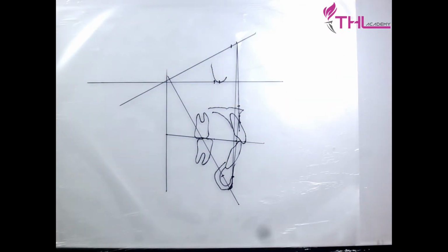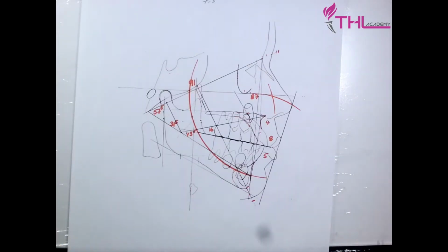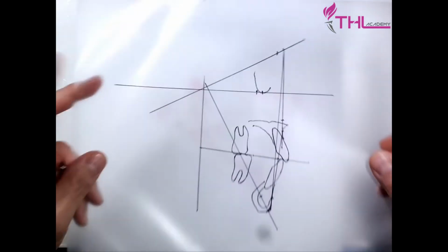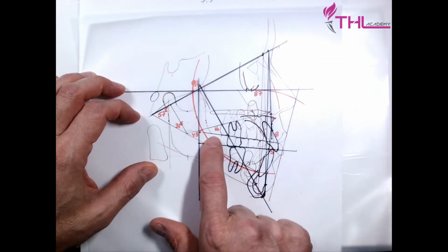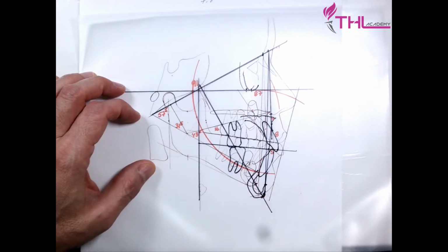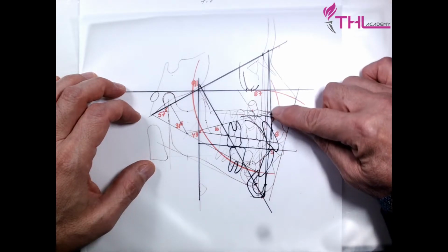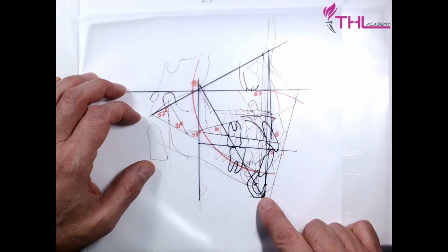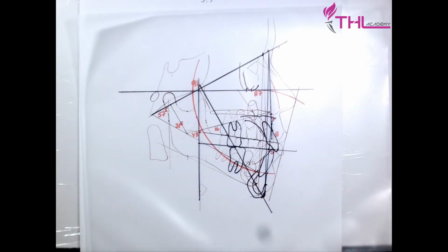This is a simplified VTO. What is the use of this? If I see this is the original patient, quickly I can put this in place and I can see the occlusal plane going down. Oh, I like that. I can see the parallel drop of the palate. I can see how much the menton is going to grow. This is with normal growth.